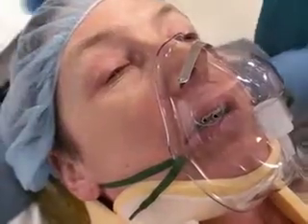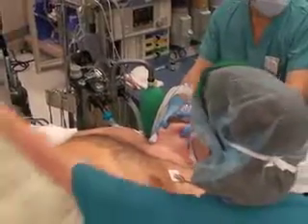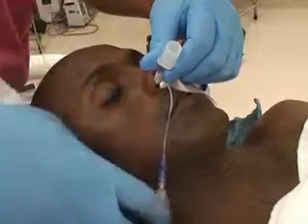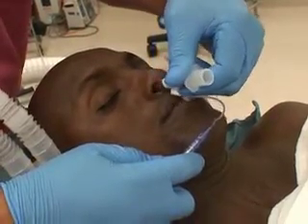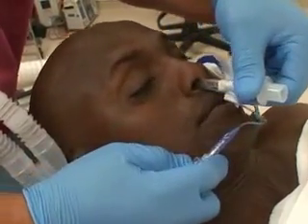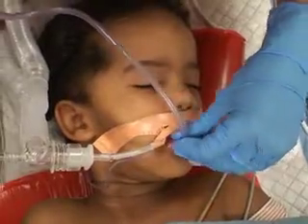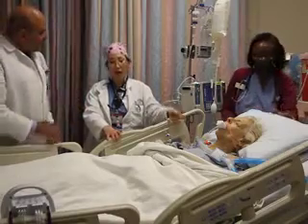In the next segments of the video, we will limit our discussion to extubation of morbidly obese patients and difficult extubation. There are many other clinical situations in which endotracheal extubation can take place that are not discussed here. For example, nasal extubation, pediatric extubation, and extubation following prolonged intubation.